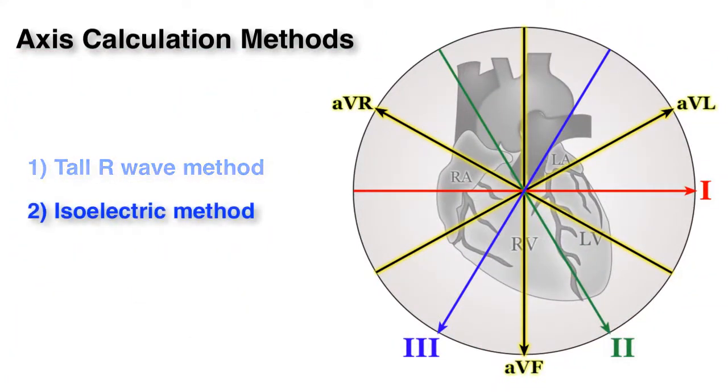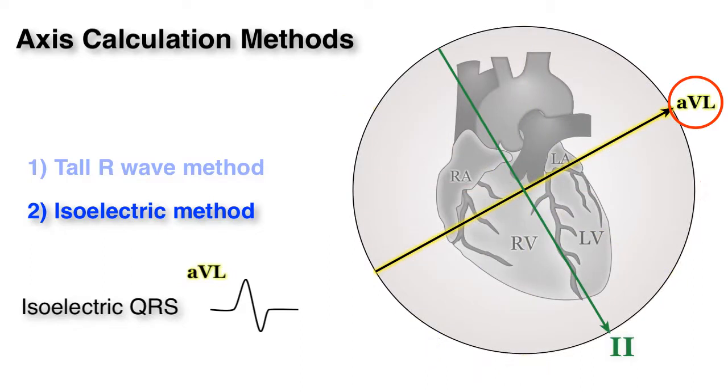Second, the isoelectric method. Identify a lead in which the QRS is precisely isoelectric. The mean QRS axis will be pointed perpendicularly to that lead. Sounds complicated, but let's go back on this EKG.